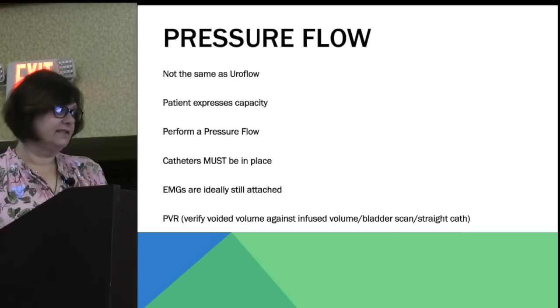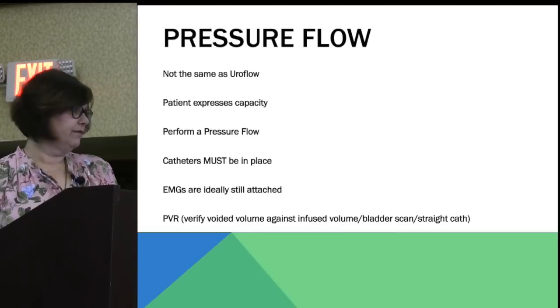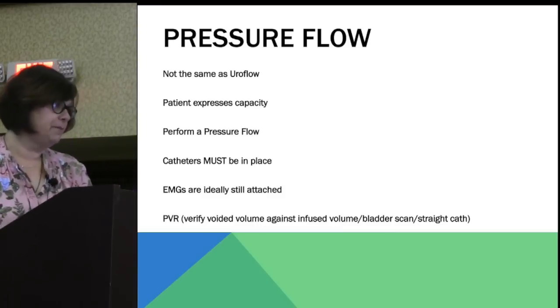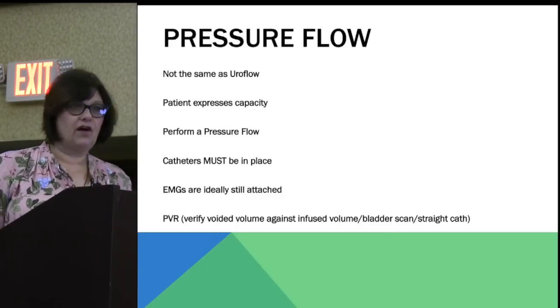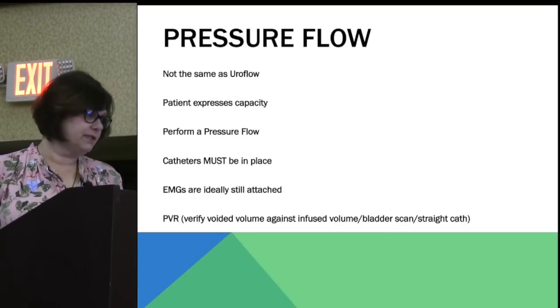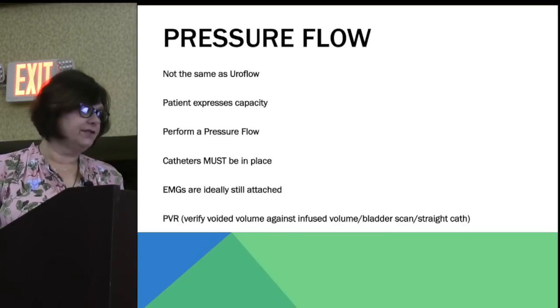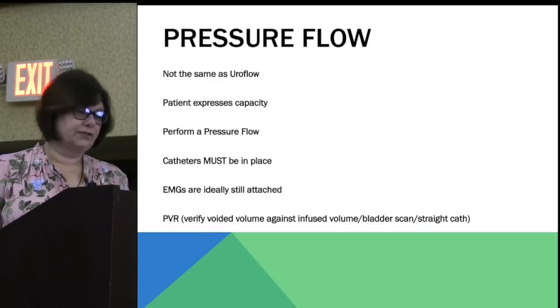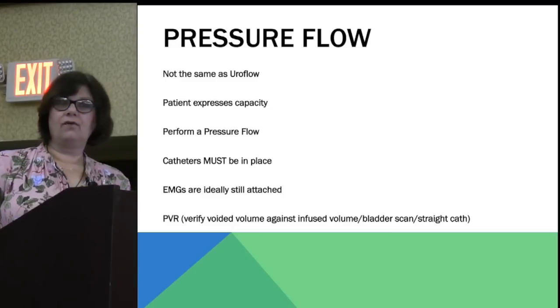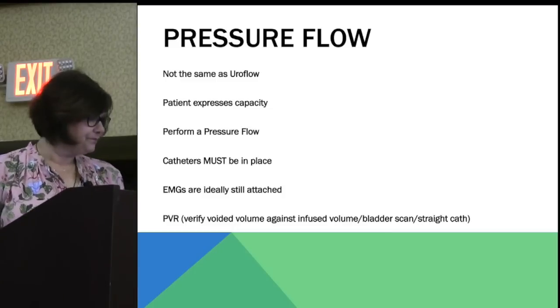Sometimes it's not the easiest thing to do on some patients, but make the effort and do it to get your information. And the EMG patches are also, ideally, in place. If they've loosened up or fallen off, reattach them, put some new ones on, because you're seeing the activity of the pelvic floor in addition to seeing the pressure that the bladder is exerting to void. And then always get a PVR afterwards. You always want to know what's left over in that bladder.